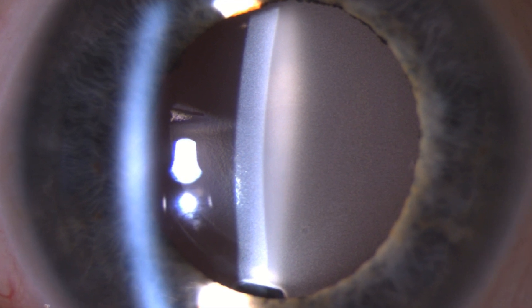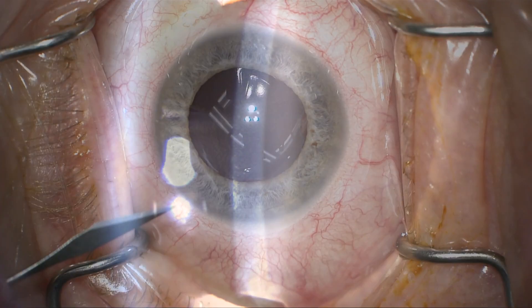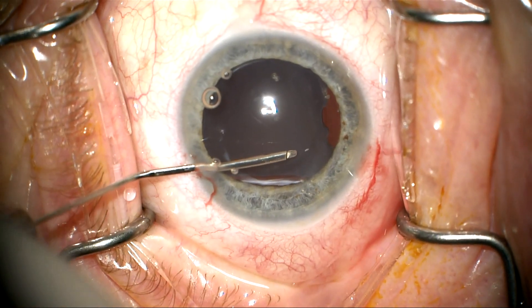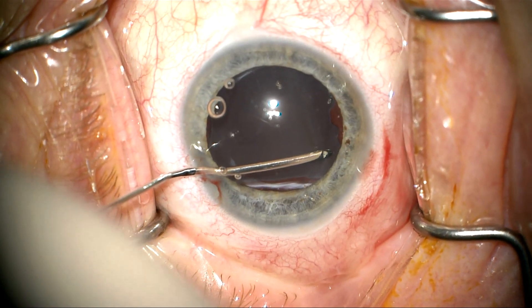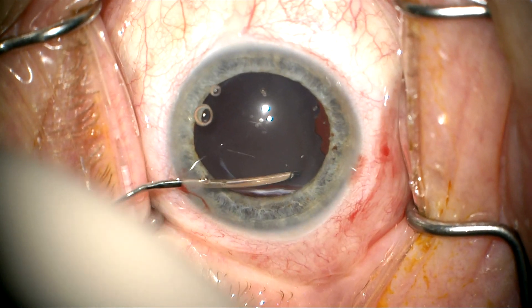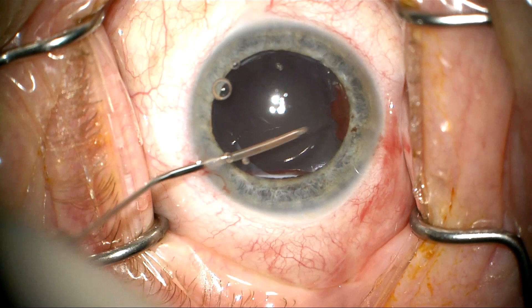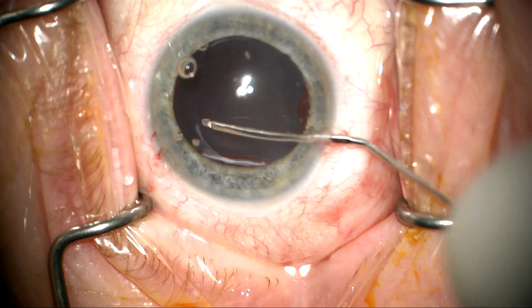This is a patient who has been referred from Australia with bilaterally calcified multifocal ocular intraocular lenses. Here we're removing the first calcified lens. In this eye, her vision is hand motion only.